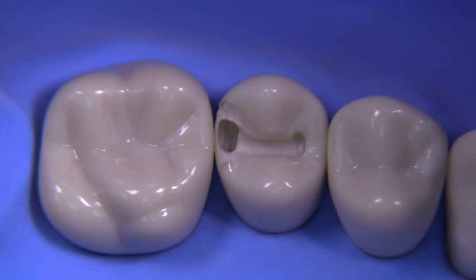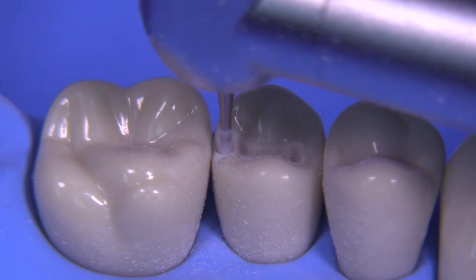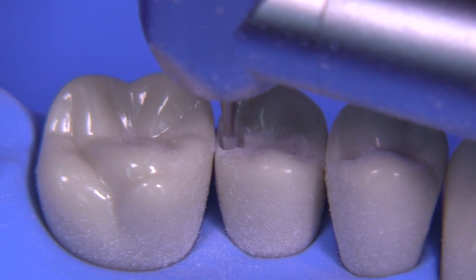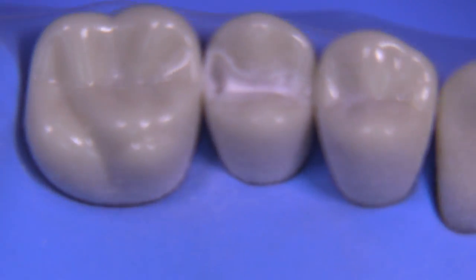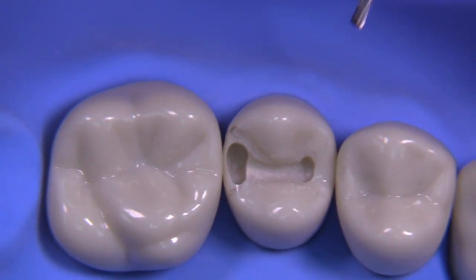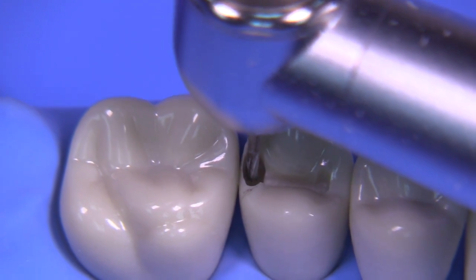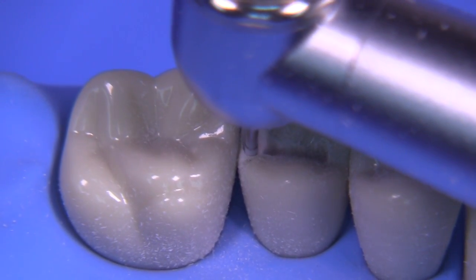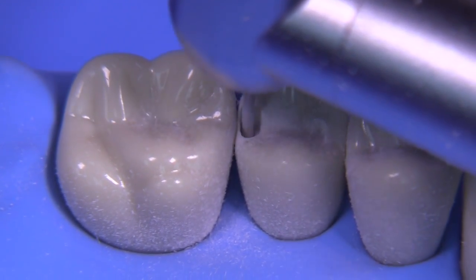It's always a good idea to leave a little bit of a shell against the adjacent tooth so that you can avoid chipping, nicks, or scratches on that adjacent tooth. If you do this technique by leaving the little shell behind as long as possible, the chance of causing an unsightly mar or defect on the adjacent tooth is definitely decreased. People oftentimes worry that they're going to go too deep axially — too close to the pulp in that direction. I don't think that is an issue as long as you keep the shell quite narrow, because once you break contact and move the burr mesial-distally and buccal-lingually, you really have a lot of room to move the burr around.